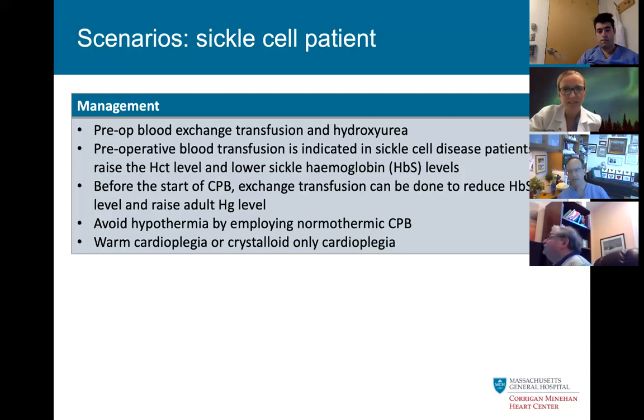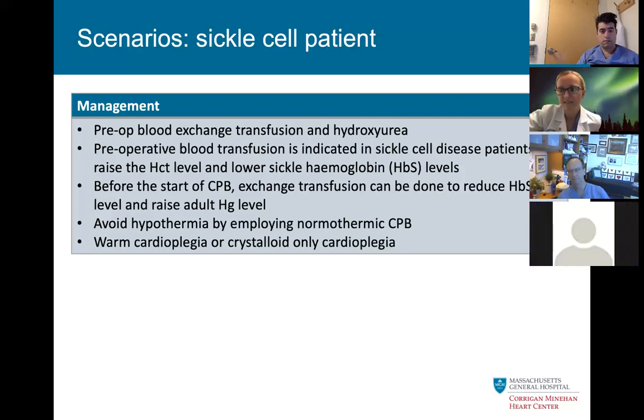Duke, did you have any sickle patients at Hopkins? Quite a few. And I think Antonia's summary of the management is exactly right. That's exactly what we did, and we just used crystalloid cardioplegia for that group as well.